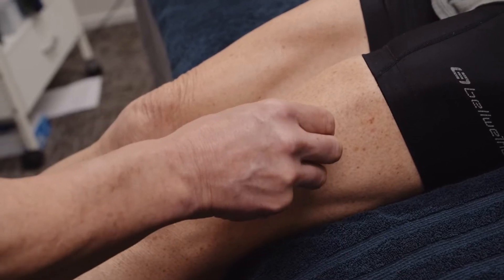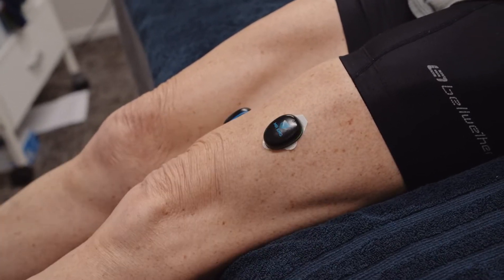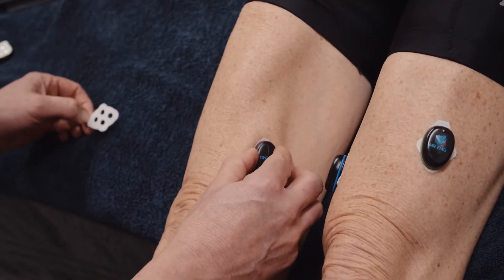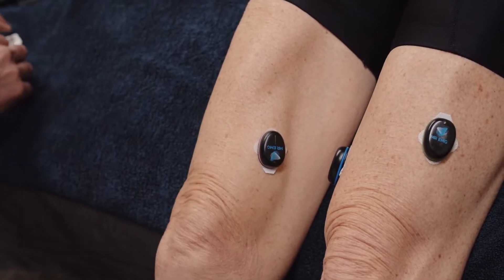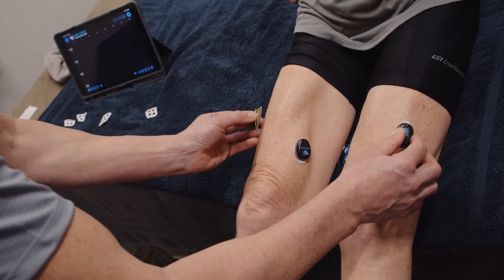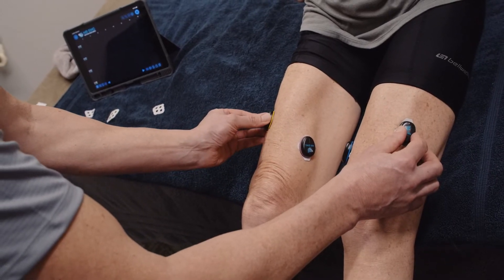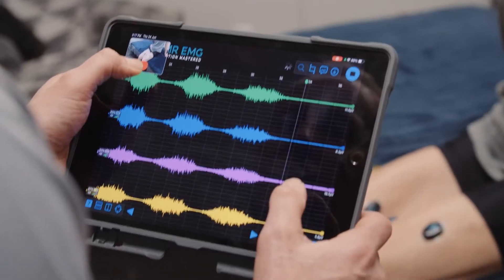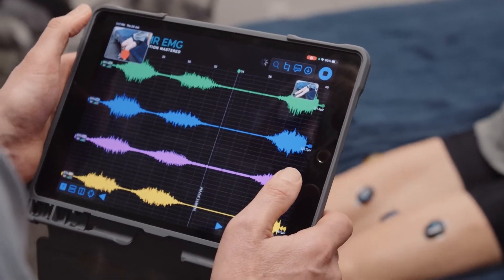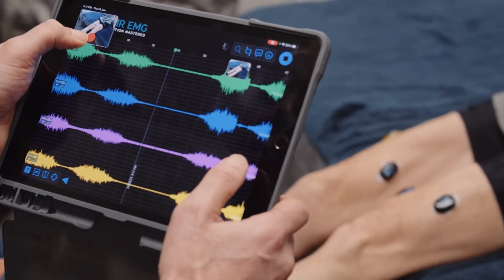Place sensors on your subject's quadriceps. In this instance, we will compare the vastus medialis and vastus lateralis of both quadriceps. Follow our recommended muscle placement sites. The quadriceps muscles you test are entirely up to you, the clinician. Take a picture of sensor placement for reference when referring back to data analysis.